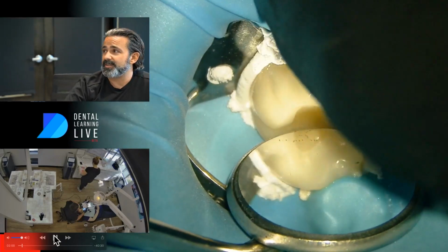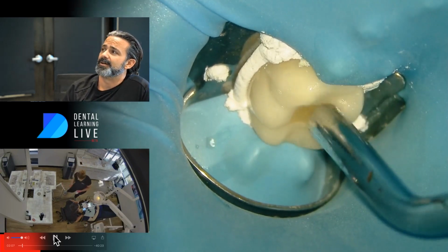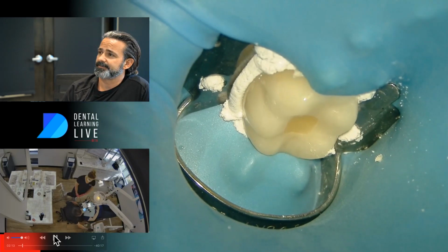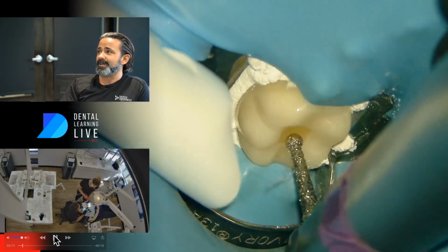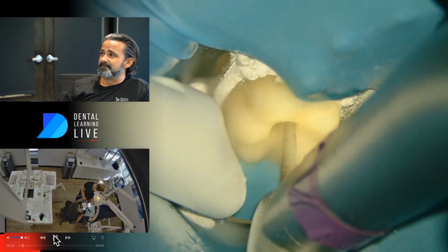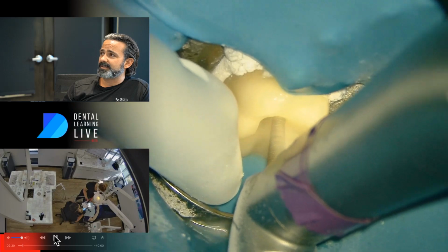This crown was pre-existing the first treatment, so you can see that we're going to re-access. You can identify the composite filling, a little different color. Let's get this into focus here. Great. All right, so the burr choice, like I said, there's a lot to pick from. I'm using the diamond. It's just an endo-access burr. And let's just get through this composite.